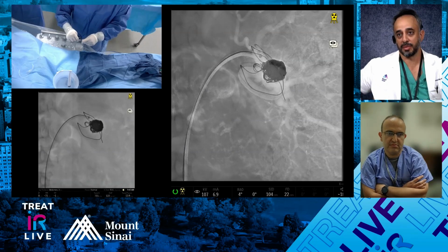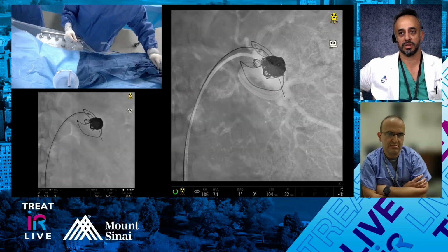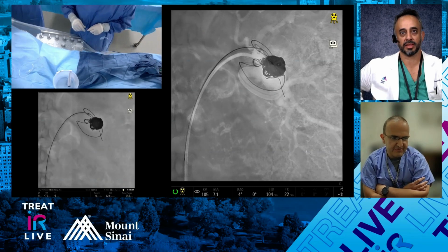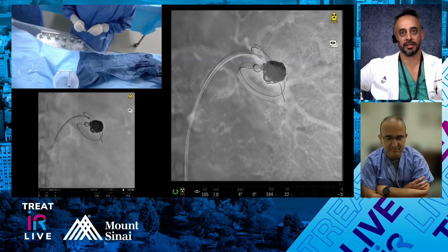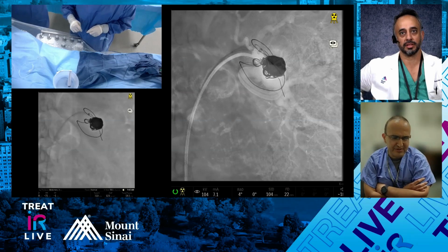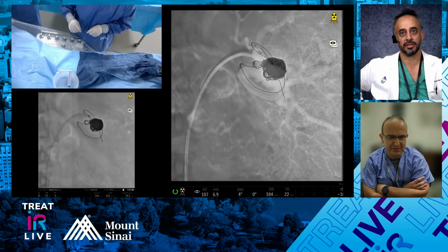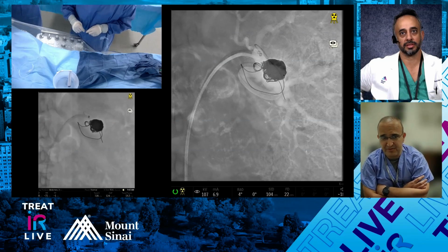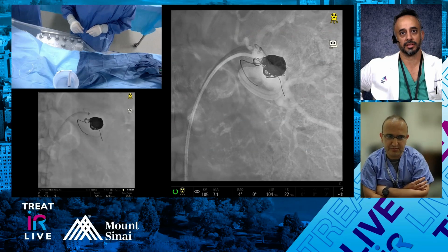So, I mean, we don't do trauma anymore. I think you guys still do. Yeah, at Georgetown we don't get much trauma, but when I was at hospital center, definitely, like you said. I'm old school too. I oversize a little bit. And like you said, the coil determines it a little bit too, if it's really stiff or soft, and what setting you're in. So I oversize by like 10-15% for most coils.